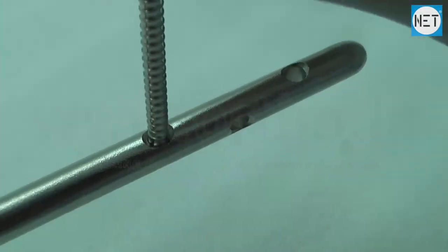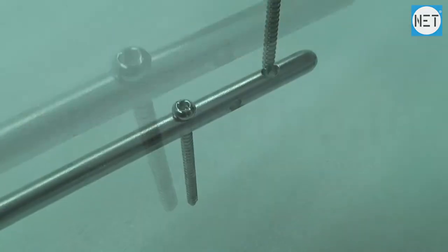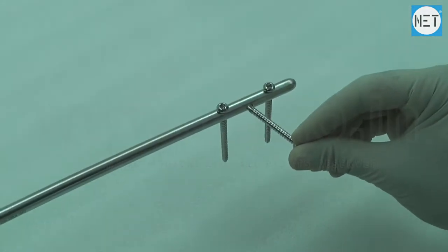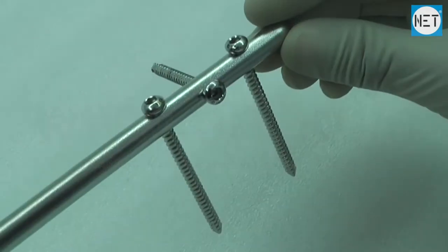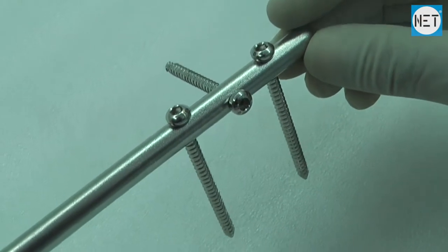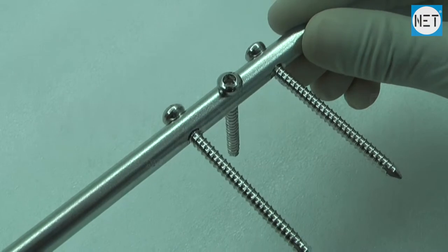All three distal holes allow for 4.5mm locking bolts. The first and third holes from the bottom are directed lateral to medial, and the second hole is directed anterior and posterior.